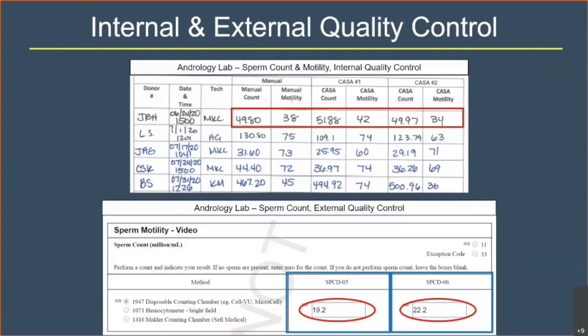These values are compared with other labs, and our values reported in the lab have to fall within mean plus or minus 2 standard deviations of the overall results. Then we meet the EQC criteria and establish that the results from the lab are accurate as well as precise. Next slide.